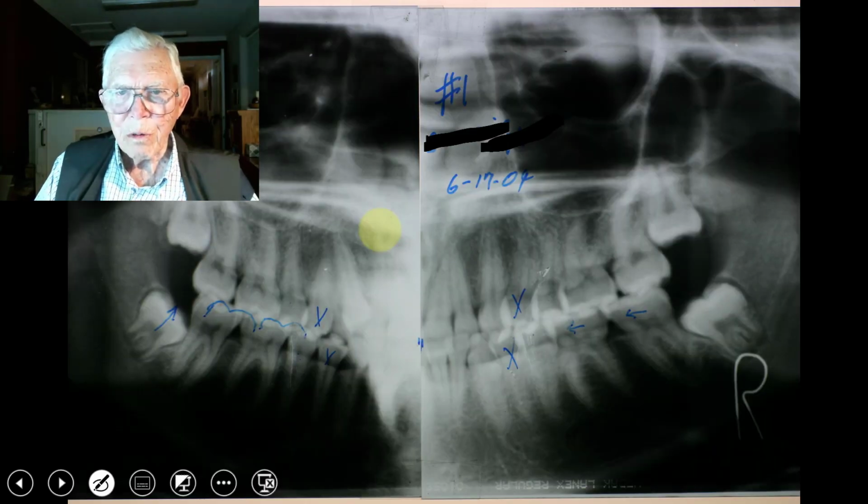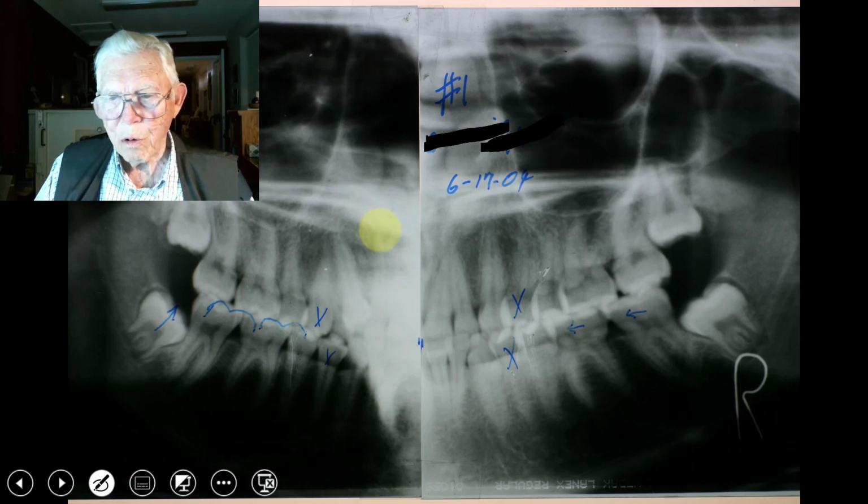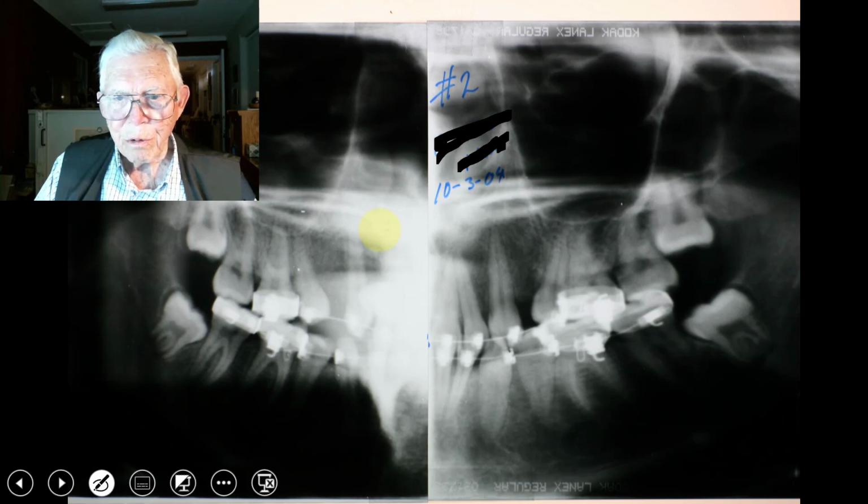So here are the Panorex X-rays. I've got about 5 or 6, I think, here. And we first saw her, and she was wanting to do this, so we took a Panorex and went over and showed her the place where we would remove the teeth. And we were hoping to get room for the wisdom teeth, but I still don't know whether they made it in or not. This was '04, and this lady, I don't have her age here for a good bit, and so we let her decide.